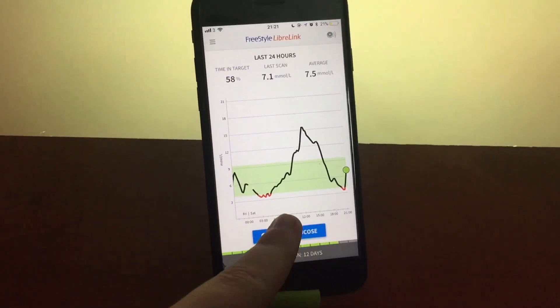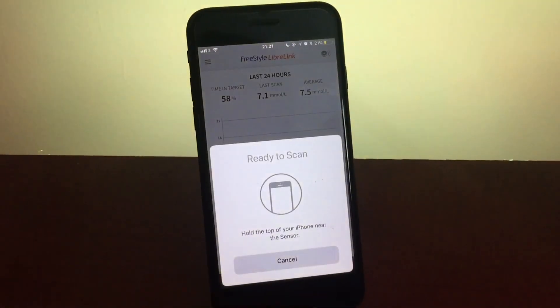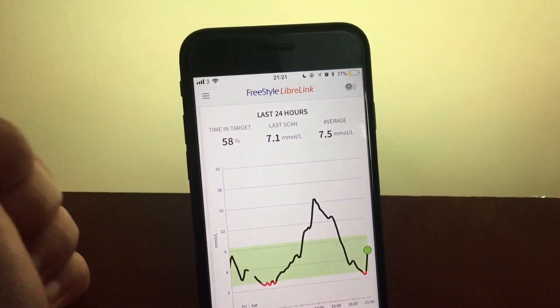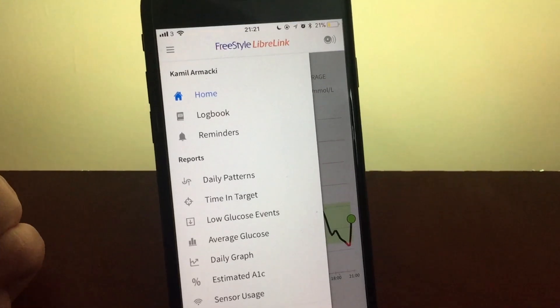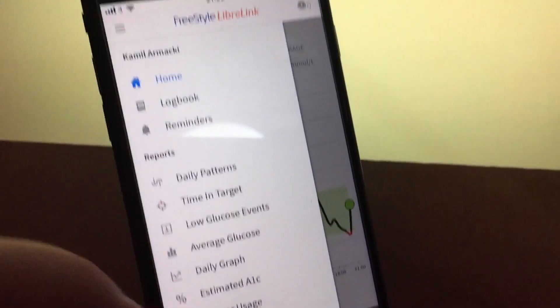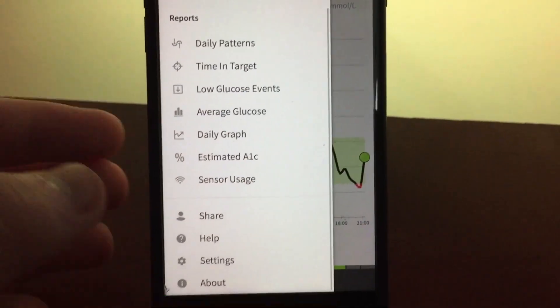In terms of functionality, the Libre Link app on the iPhone is very similar to the Freestyle Libre Reader. You are able to add things like notes, your insulin intake, your carbohydrates, and notes which you can actually type — like 'I've just had a shower.'